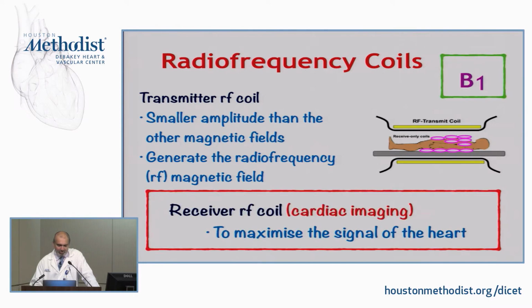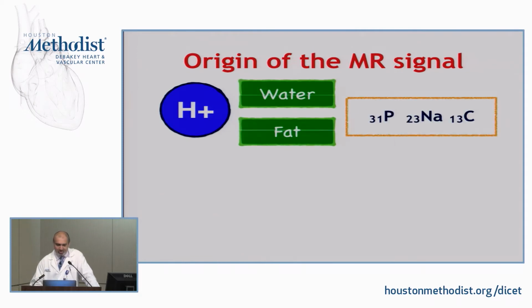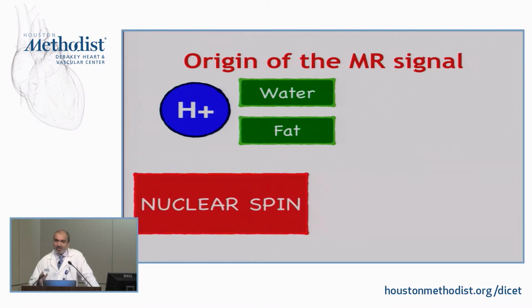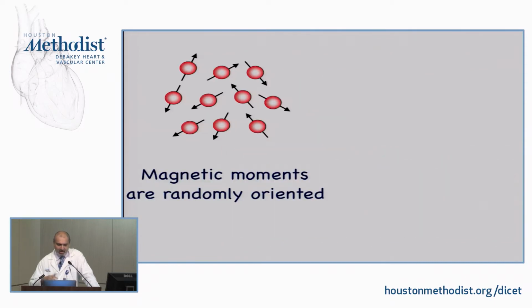And so what happens to protons, to hydrogen atoms, when they're faced with a magnetic field? Well, they will start to spin around. And they'll spin around in such a way that they line up in the direction of the magnetic field, and then they spin around in a direction that's transverse to the magnetic field that you've lined up. So let's get forward here. And this is basically if we have no magnetic field, you've got protons that are spinning around in all different directions. Some are upright, some are down. And the net, if we summate all of these together, is 0.